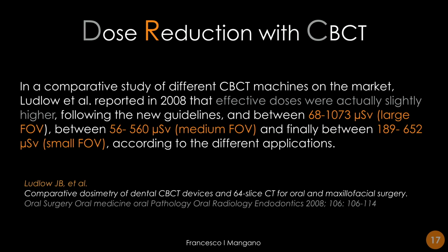And other papers with different researchers involved, Ludlow and colleagues, confirmed that we have, of course, a range and some variability across the dose given by the different machines and using different applications by the different cone-beam computed tomographies. But anyway, the effective doses were absolutely lower than those given by a medical CT.